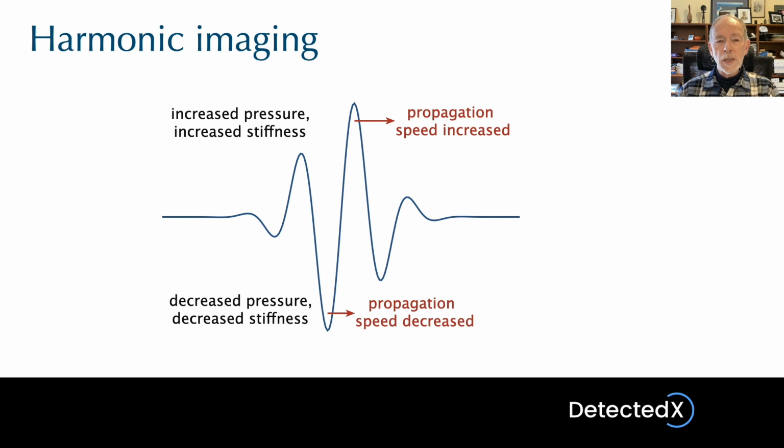At the troughs, the places where the pressure is minimum, the tissues are going to be decompressed, and this reduces the propagation speed, and so those troughs are going to travel a little bit more slowly. So over a distance, as the ultrasound is traveling, the peaks will gradually become more advanced and the troughs more delayed relative to the rest of the waveform. So the waveform is no longer going to be a nice sine wave in its shape. It will become asymmetrical, and this has implications relating to harmonics. I'll show you that in a moment.